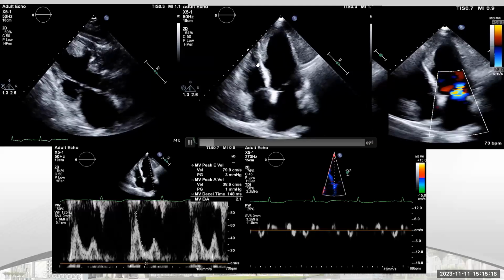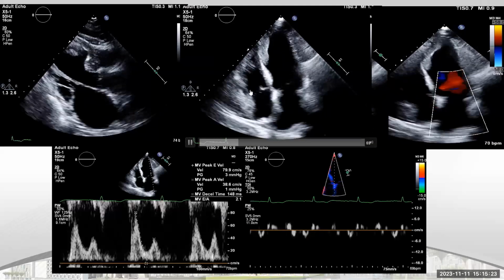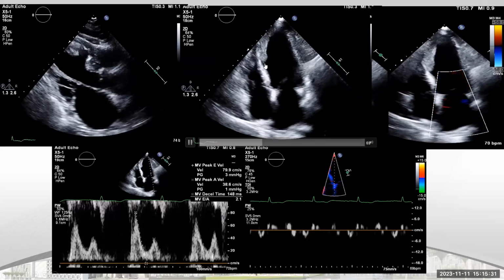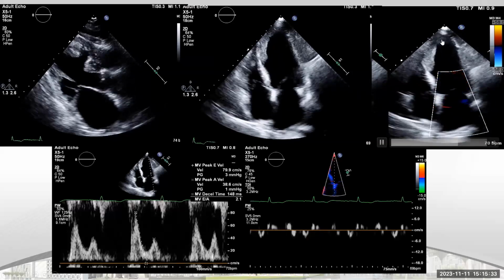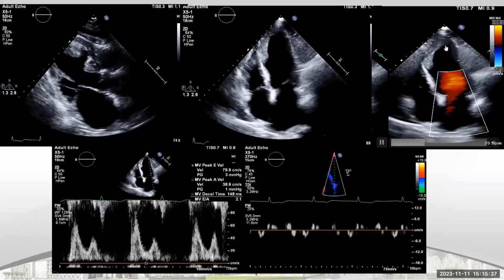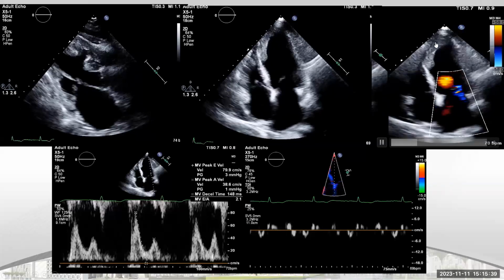And this is an indication of restrictive cardiomyopathy or just a restrictive-like pattern of diastolic dysfunction. But what else here? Yeah, excellent. There is a thrombus. There is a large thrombus. And there is also dyskinesia of the wall. It is not aneurysmal, and we don't have a hinge point, and this is just thinned out wall. You can see here, thinned out wall. Okay, if you pick up aneurysm, it's okay, acceptable, because of dilatation. So dyskinesia or aneurysm, and there is a big thrombus.